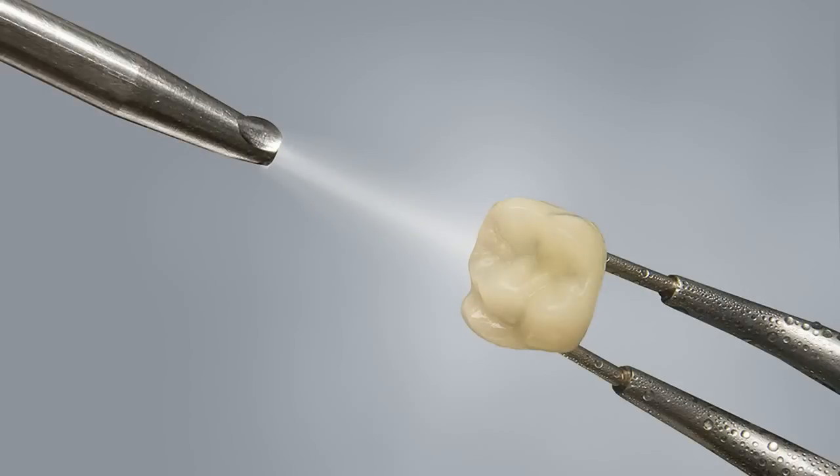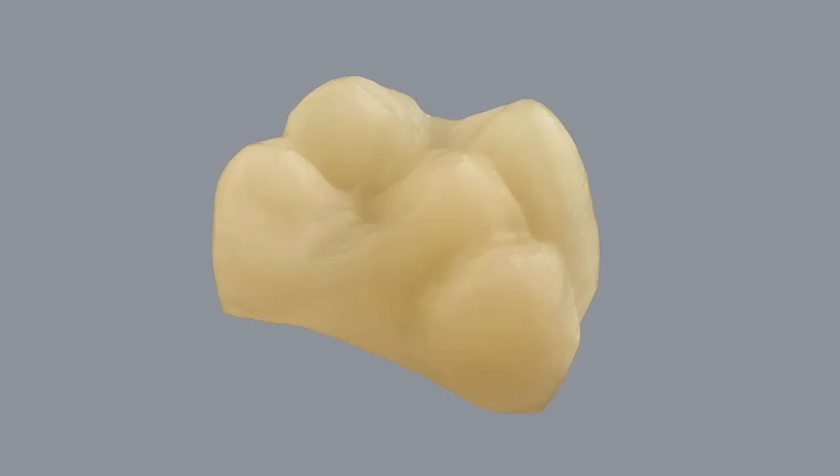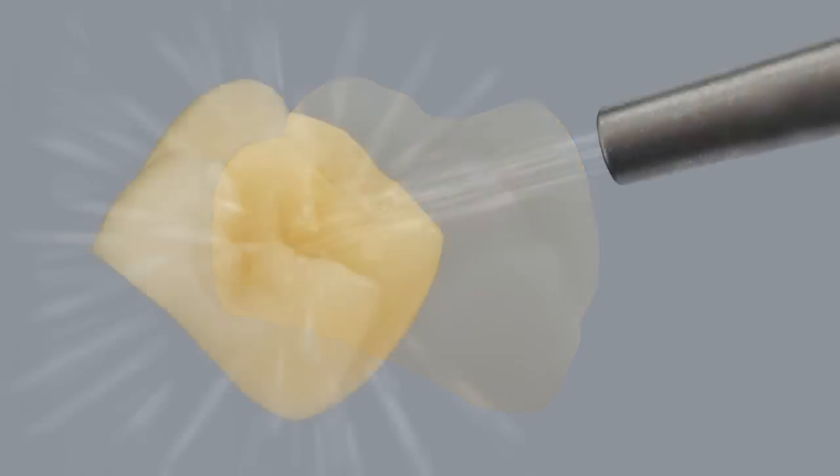Once complete, remove the residual acid by steam cleaning or ultrasonic with distilled water. The surface should appear frosted white in appearance. The alternative option is to microblast the surface with clean alumina oxide at 50 microns at a pressure of 1 to 1.5 bars. Surfaces must then be cleaned thoroughly either by steam cleaning or ultrasonic with distilled water.